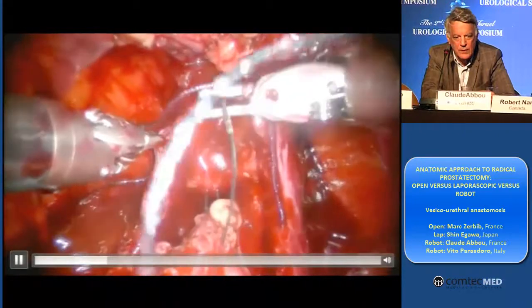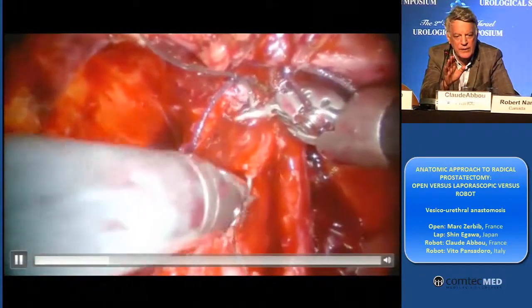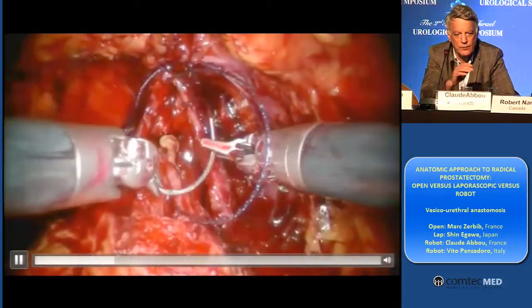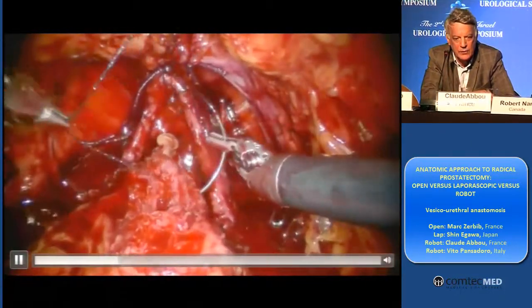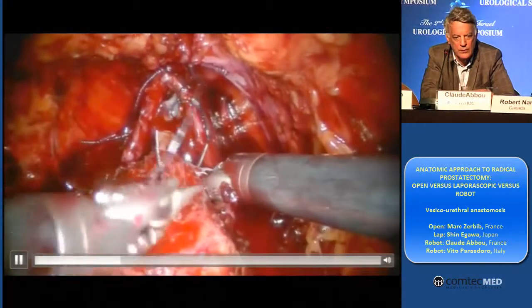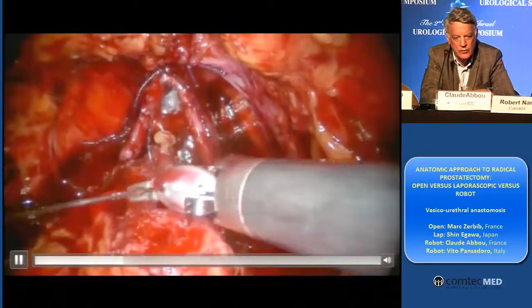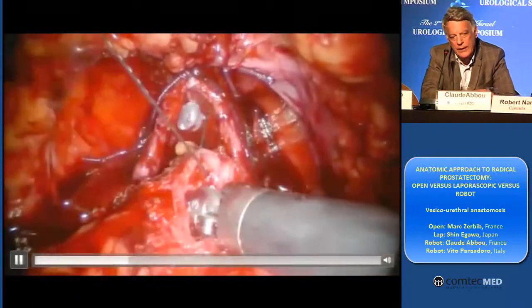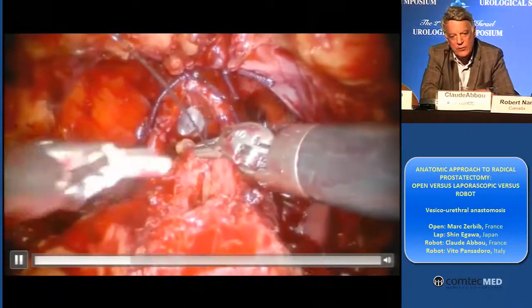You see that even in this patient, we are in good condition for making this anastomosis. We just have to push the optic and we will be in good exposure and good vision. How many passages do you do? I can tell you — if you do only two passages, you have a stricture.